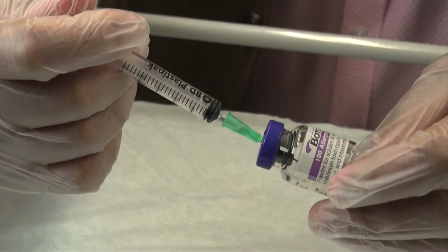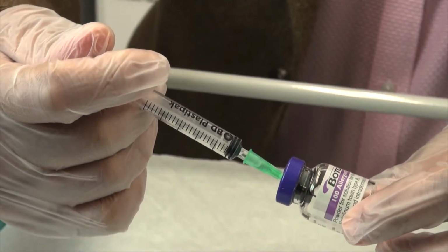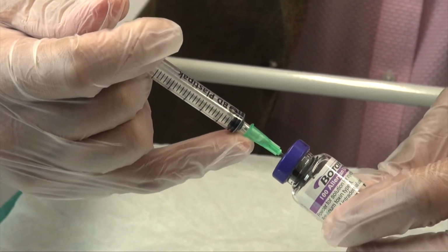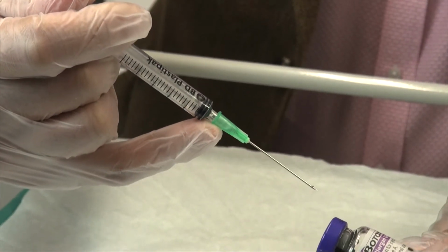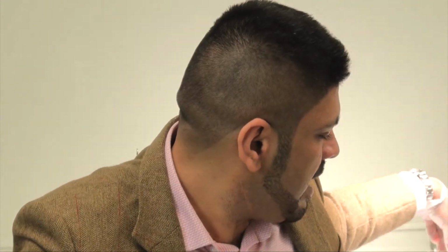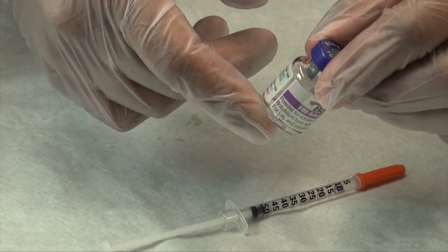So the way of making sure that the toxin remains in the vial is by keeping the thumb pressed firmly down on the plunger and retracting the whole needle and syringe in one go from the vial, leaving our solution of Botox nicely intact inside the vial. So now we have 100 units in 2.5 mils of saline.